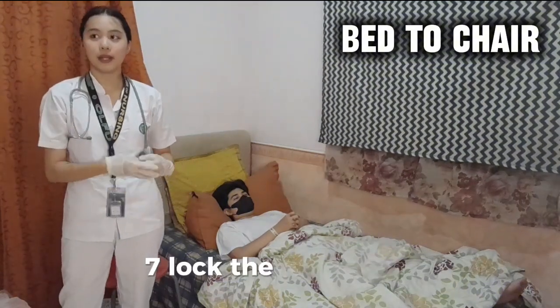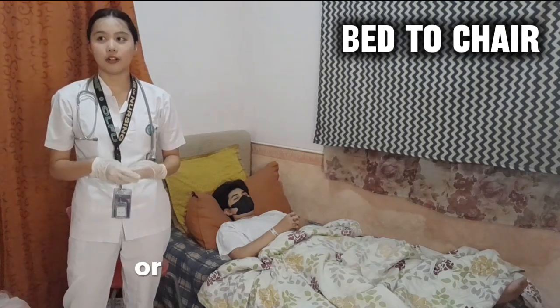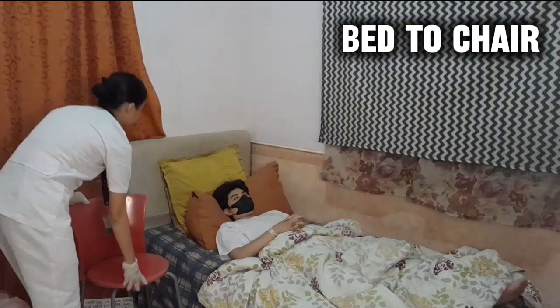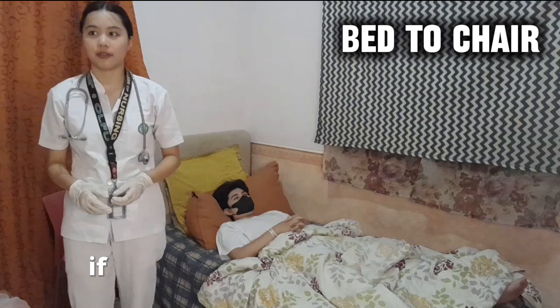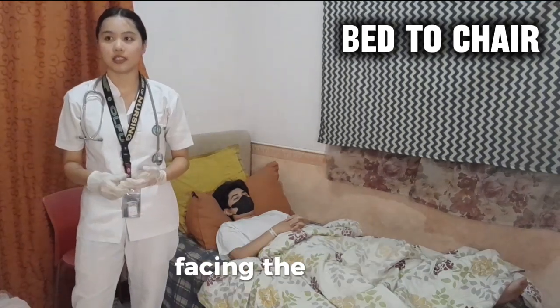Seven, lock the bed wheels. Place the chair beside the bed. Then lock the chair wheels, or if it doesn't have any, make sure it's braced against a wall. Next, let the patient use a stand assist device if available to have them move toward the edge of the bed and lie on the side facing the chair.